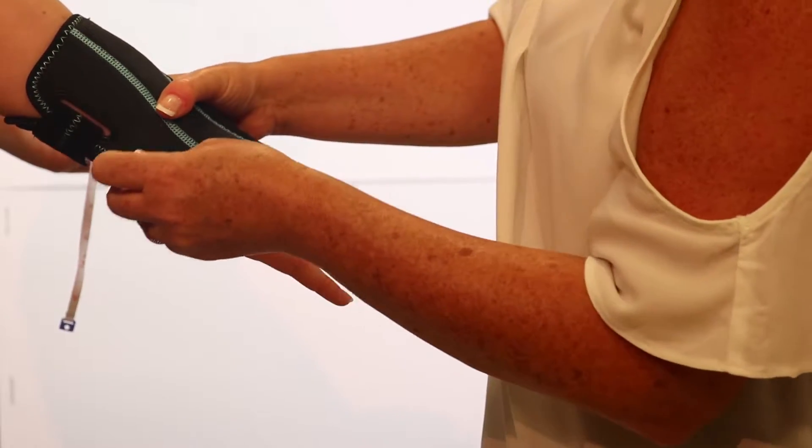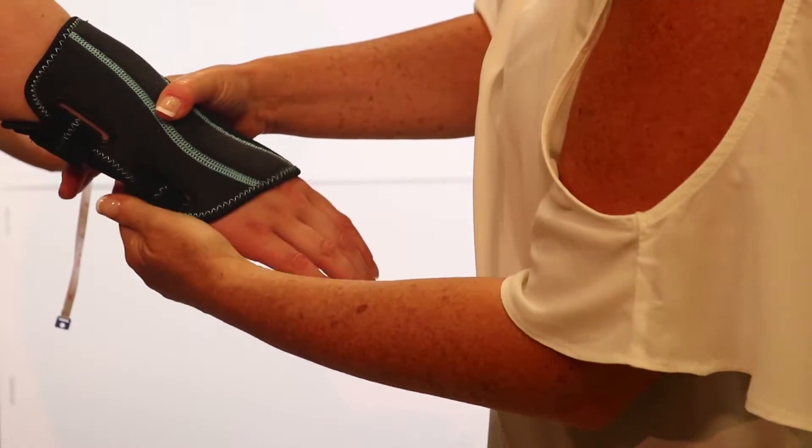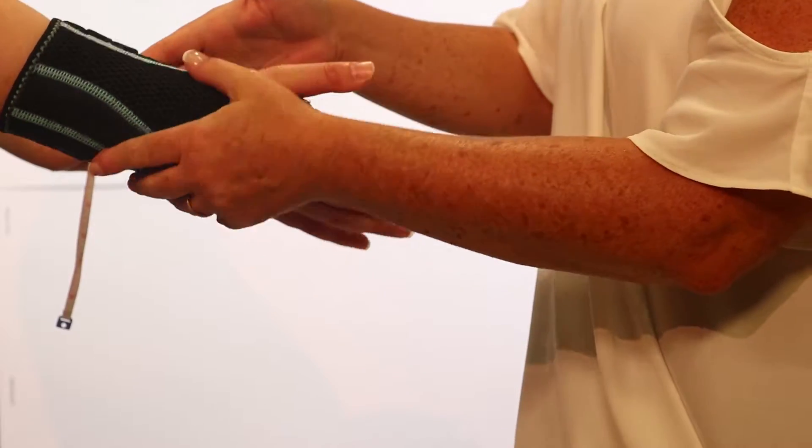Next, secure each of the two straps by pulling them across the side of the wrist and attaching to the base on the palm side of the wrist.